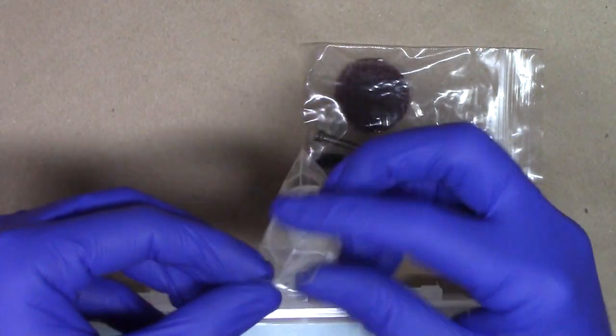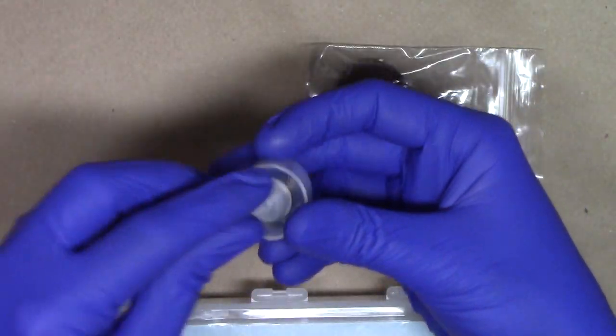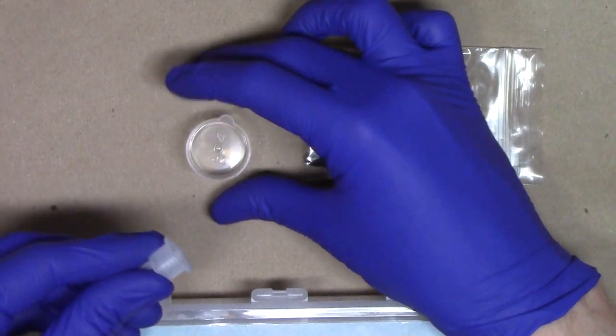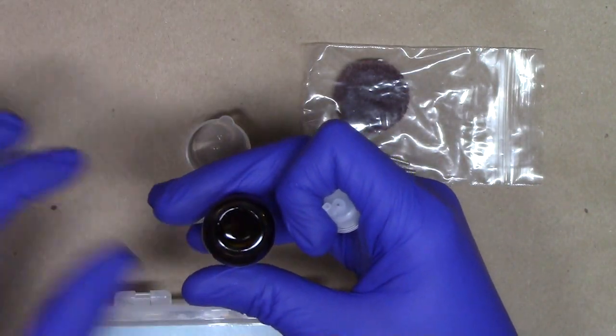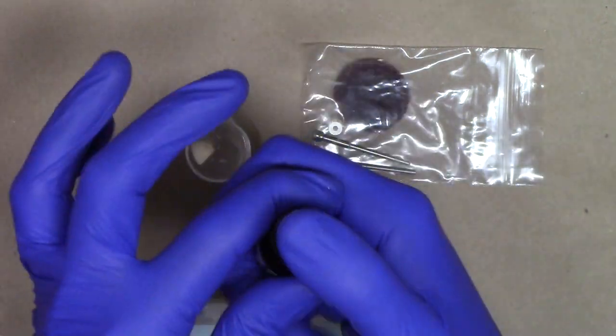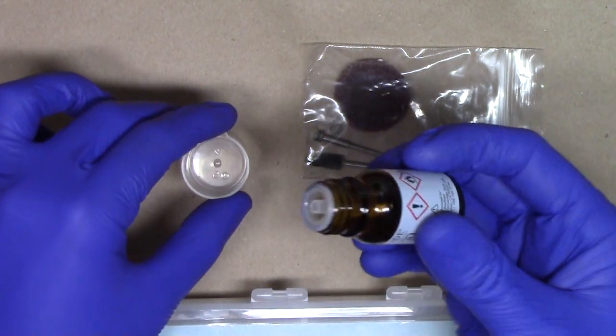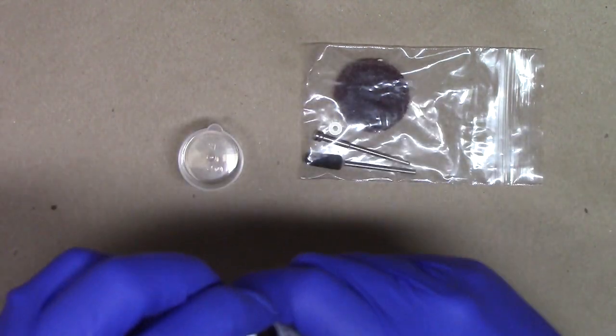First thing that I like to do is go ahead and open up this little individual baggie, and inside of here is just this really convenient little dish. As I take that, I want to put this on the inside of my primer, so that way it's now able to drop out of that container or of that bottle.